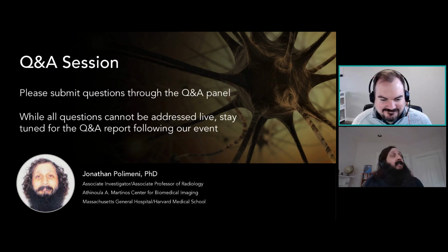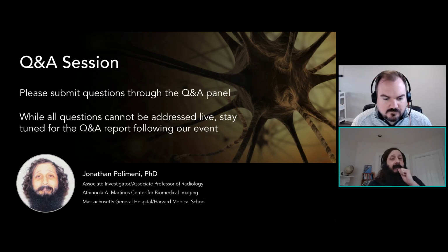Yeah, differences are vast. What I like about fMRI is that, unlike other neuroimaging techniques, it really allows us to look across the entire brain. We use fMRI for looking at responses in the deep cortical areas, brainstem, thalamus, C-spine even. And so I think that fMRI does provide fairly uniform sensitivity and specificity across the entire brain.